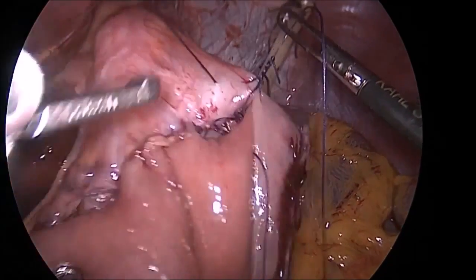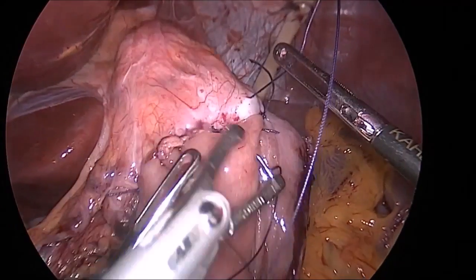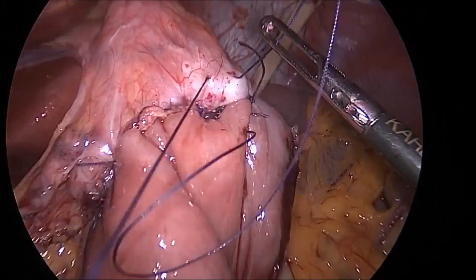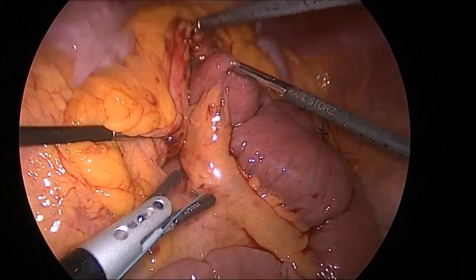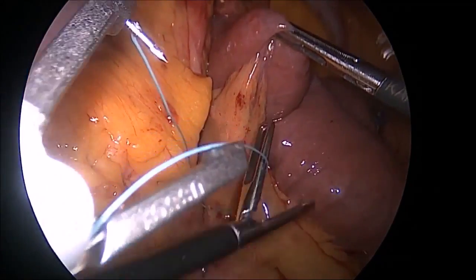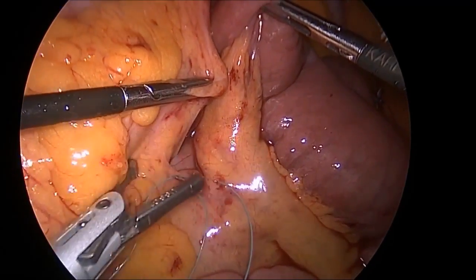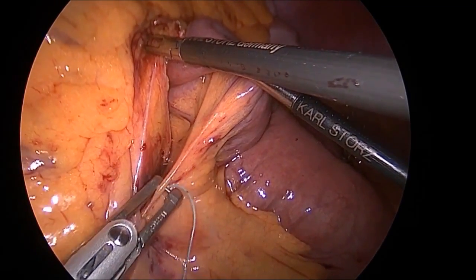Before retrieving the nasogastric tube, we clamped the Roux limb and insufflated with air to make sure the anastomosis was tight with no leakage. At the end, we sutured the mesenteric defect between the Roux limb and the transverse mesocolon using Endo Stitch with non-absorbable suture material to ensure the defect does not reopen in later years, suturing from both sides while making sure not to occlude the Roux limb.